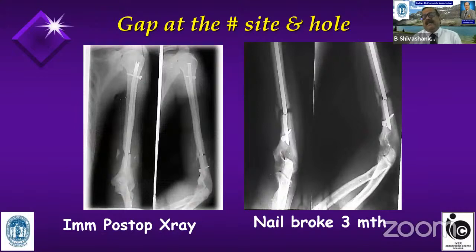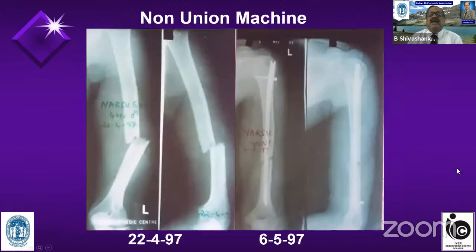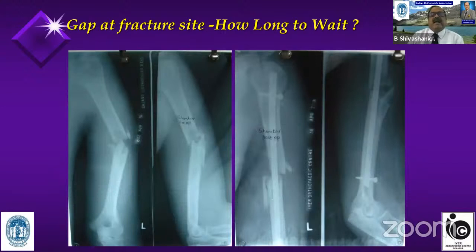Friends, nailing doesn't tolerate a gap at the fracture site. Unfortunately, the humerus is a non-weight bearing bone. Unlike the lower limb bones, the weight of the arm itself distracts the fracture site. So never ever get fracture site distraction. So this will act as a non-union machine. So, gap at the fracture site.